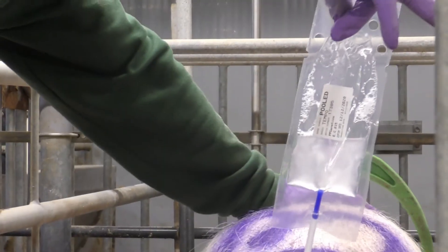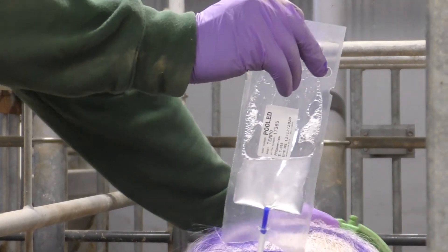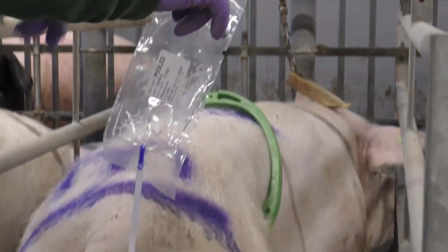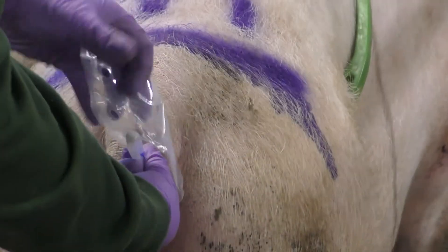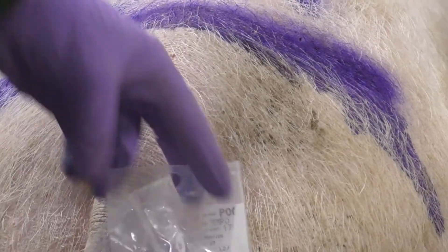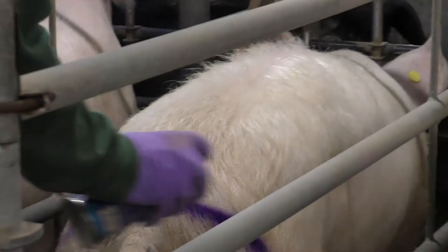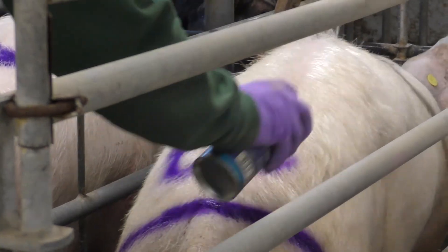Leave the catheter and sandbag or pig body in place for five to ten minutes after insemination to aid sow stimulation and minimise any back flow of semen. Kink the end of the catheter shaft protruding from the vulva and hold this kink by inserting it into the strengthened plastic ring at the top of the semen bag.